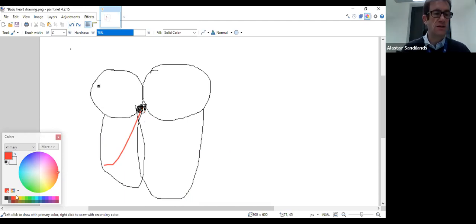Right, so let's go back. If there's a problem with the AV node, it will tell you whether there's some function of the AV node, but it's very slow. So first degree we've talked about. Wenckebach, you have to imagine that there's prolongation of the PR interval at every beat.